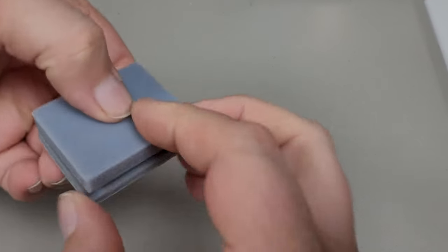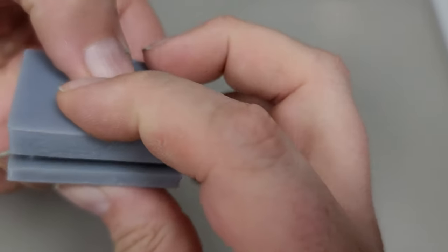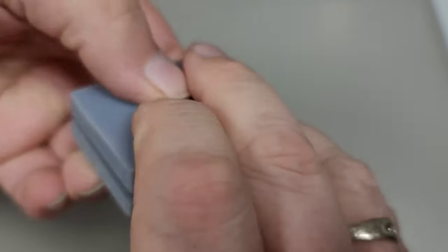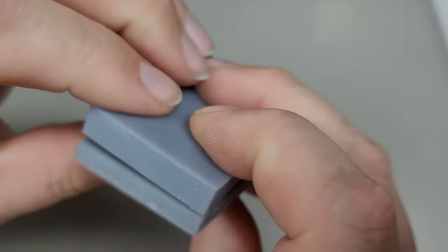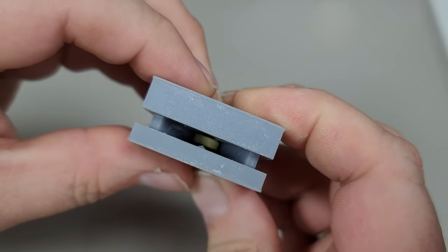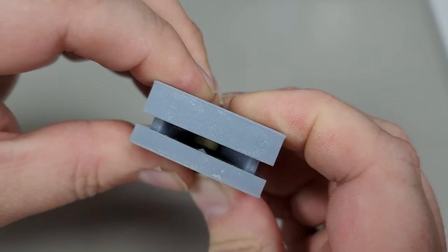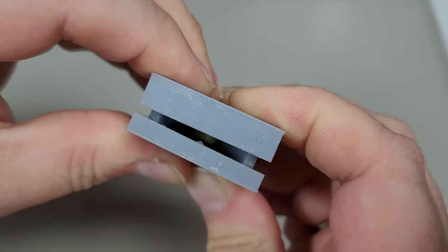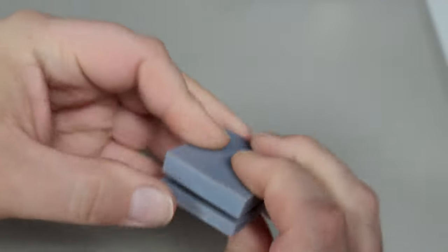And now, ready? I'm going to just give it a little squeeze. There we go.